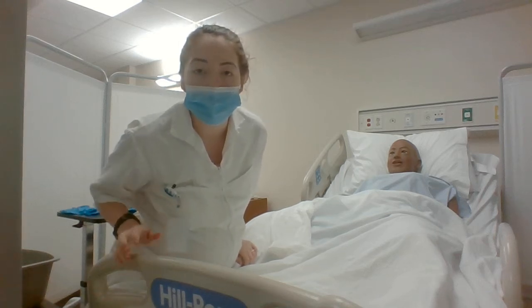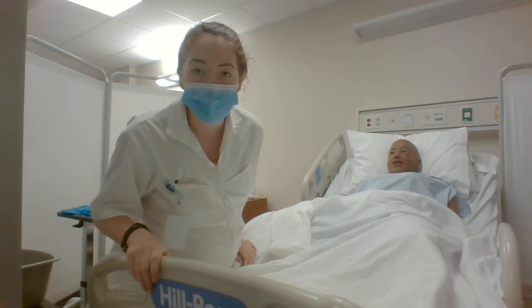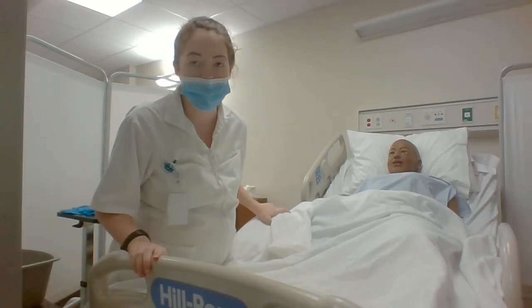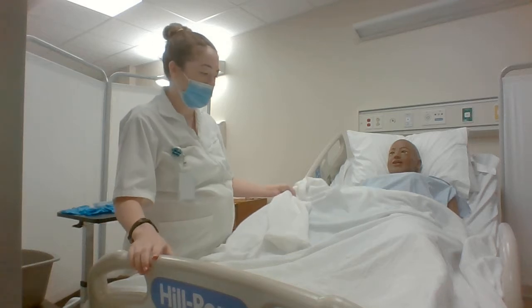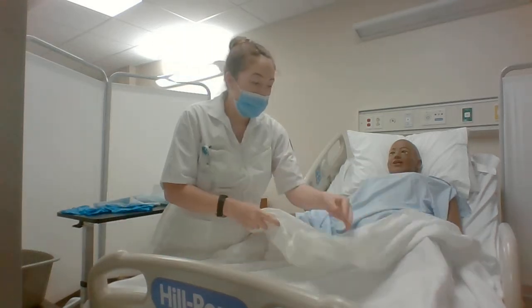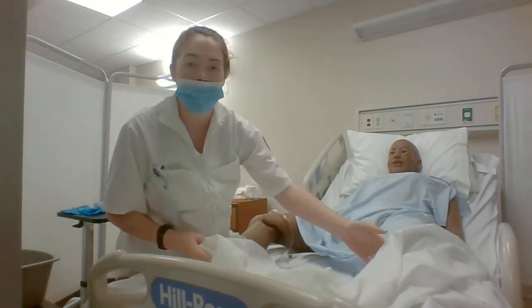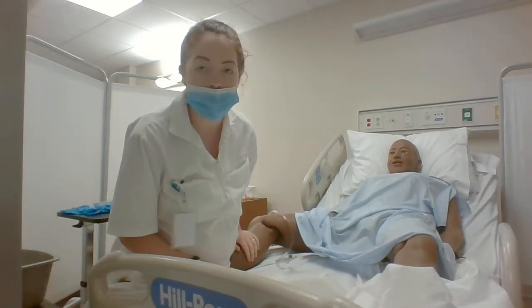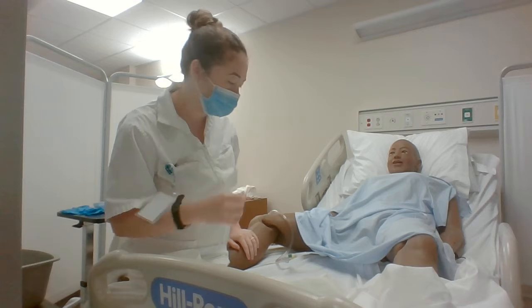Hey, my name is Madison and I'm going to be performing catheter care. First, I would identify my patient, verify my physician's orders, and then I would make sure the patient is in a comfortable position — dorsal recumbent for females and supine position for males.